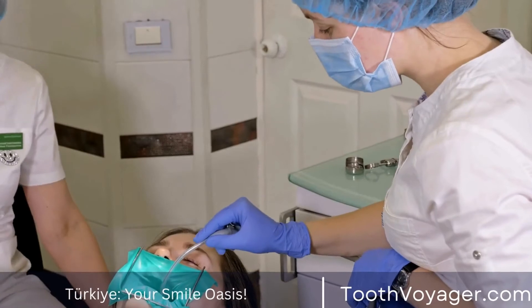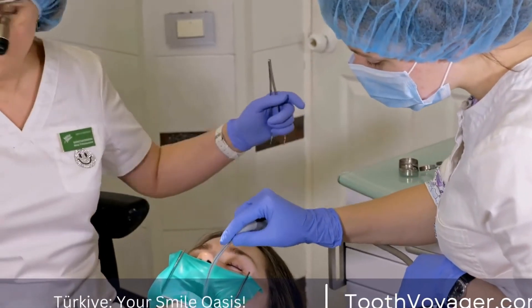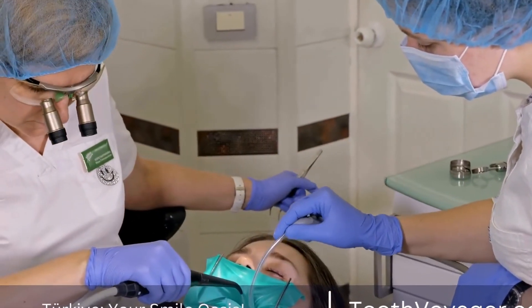Step 3 — Accessing the pulp: The dentist will make a small opening in the tooth to access the pulp chamber and root canals.